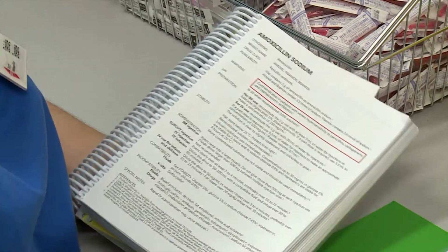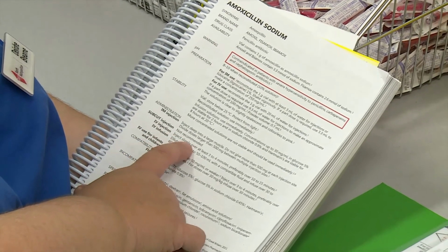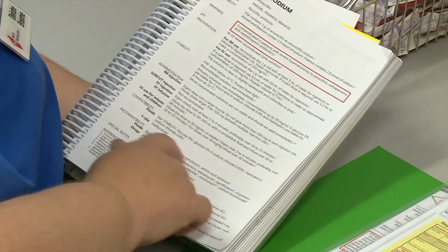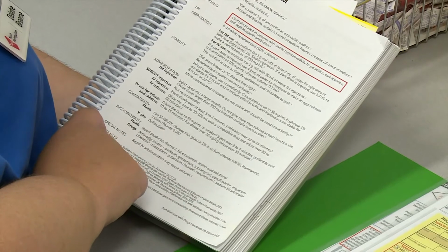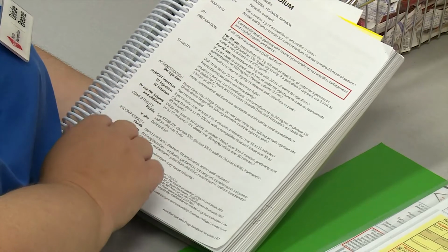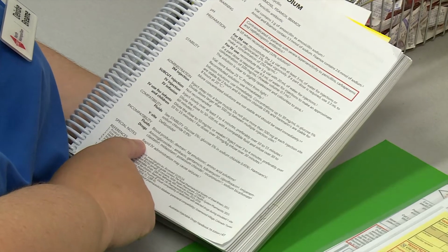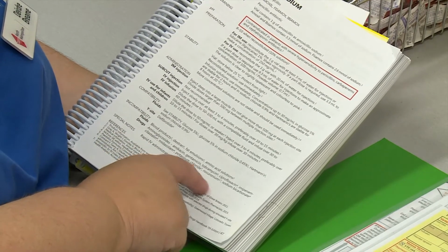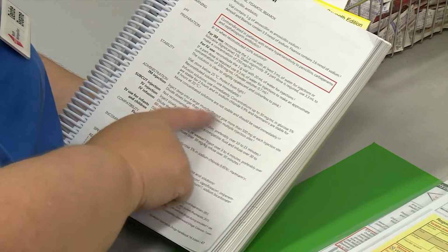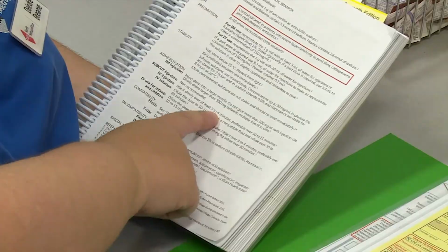And because we're giving it by IV, we have an IV injection information here, and we're going to inject it slowly over 3 to 4 minutes, preferably over 10 to 15 minutes. Check compatibility with different fluids if you had another IV running. But because we're giving it as an IV injection, we don't need to worry. And we need to look at special notes as well. Rapid IV administration may cause seizures. So because of that, we're going to make sure that we don't do it any faster than the recommended 3 to 4 minutes. Okay, so my plan is to actually give it over 4 minutes.